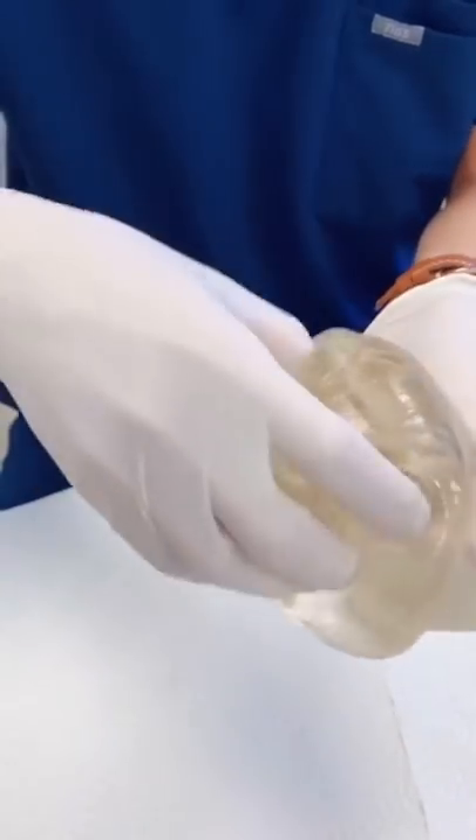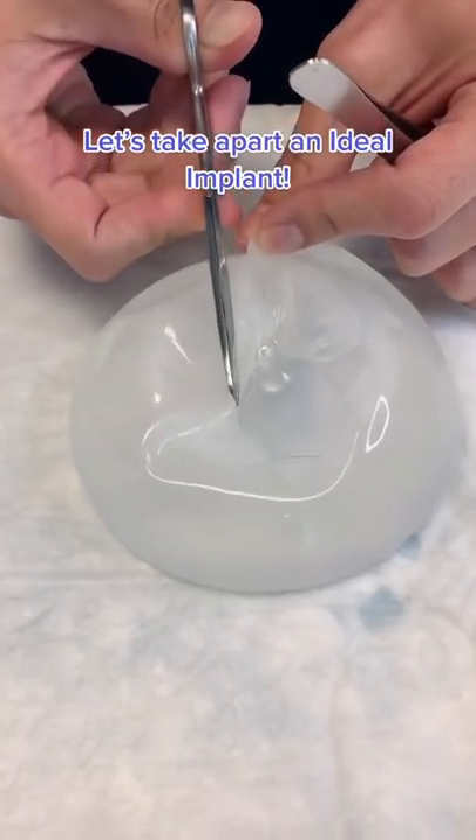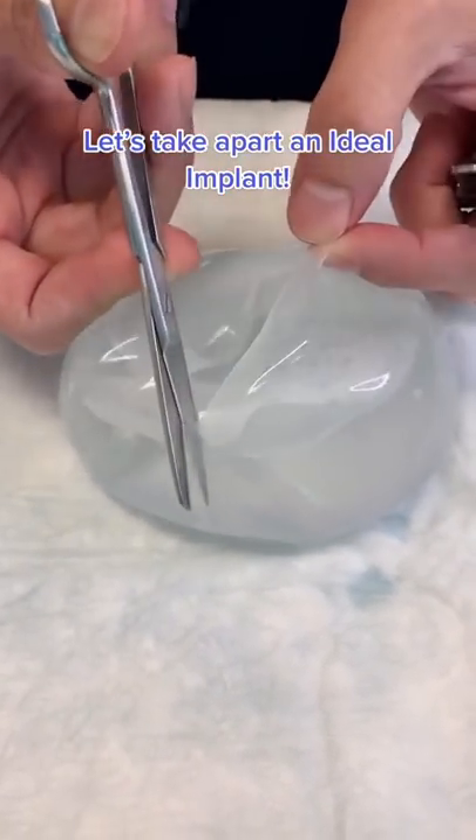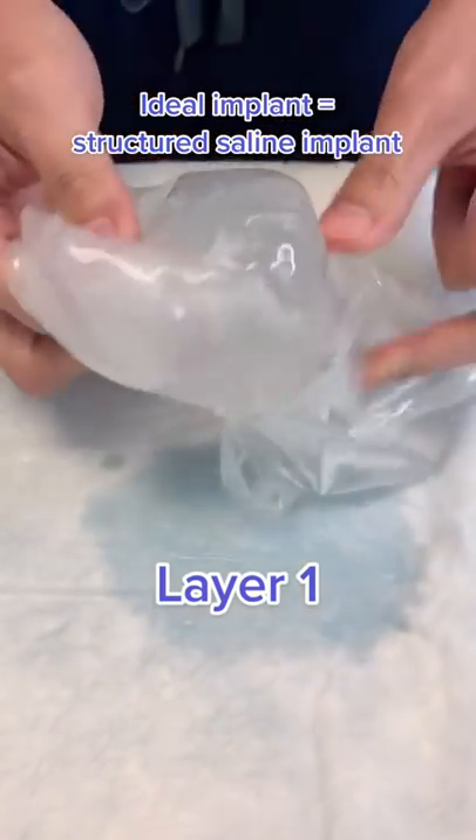You've seen me break apart a silicone implant and a saline implant, but what about the ideal implant? This structured saline implant has two chambers but multiple actual layers. I've cut the outermost layer and peeled it off right here.